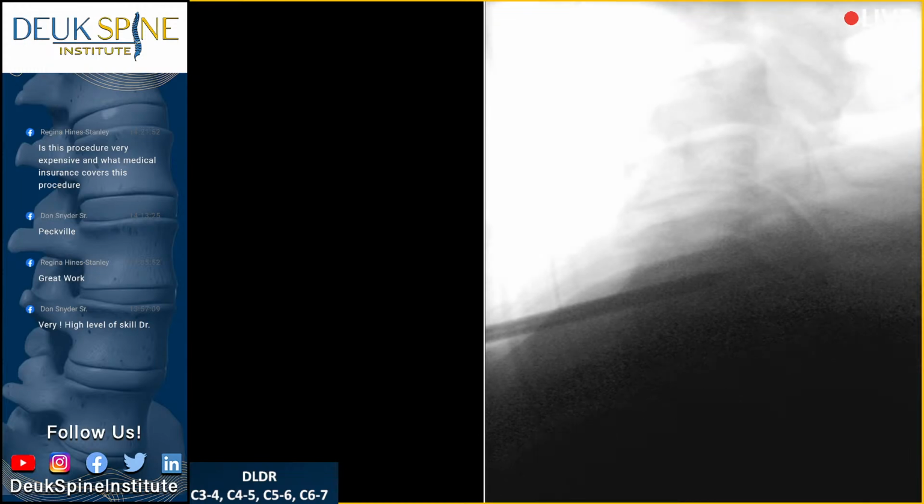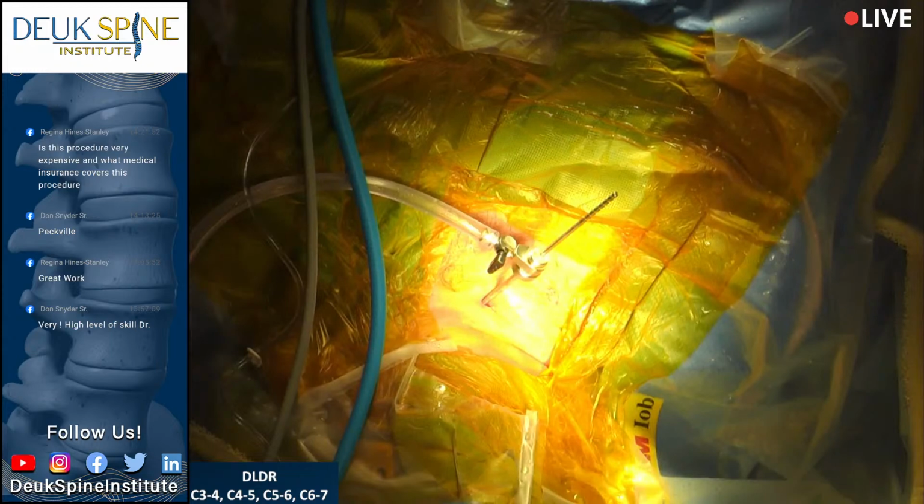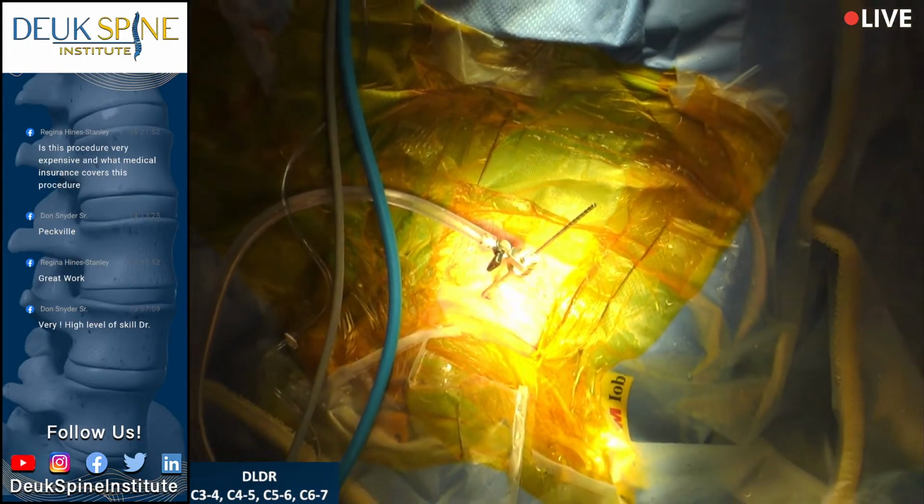Now, I have to go a long way back down here. Let's just try. We're going to try for the bottom disc. I need inline traction. Give me 1 second. I don't want anyone doing anything just yet, okay? So the first thing I'd like to do, I want to think through this because we have a complicated situation here. Jordan, are you happy with the position of your scope?